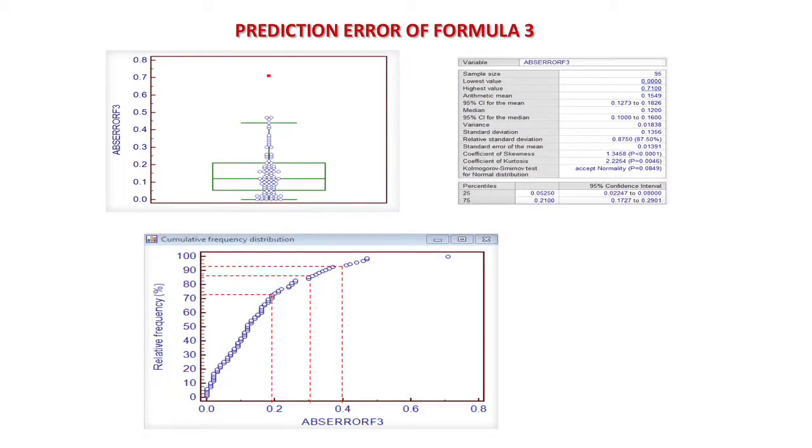And this is the prediction error, on the same group we did the calculation. So theoretically this means that this is the best result possible that we will ever get. And you can see that we can predict to within 0.4 millimeters in 94% of cases, but still there are a set of outliers, especially this one that is very, very far from the prediction. And the question, of course, is why.